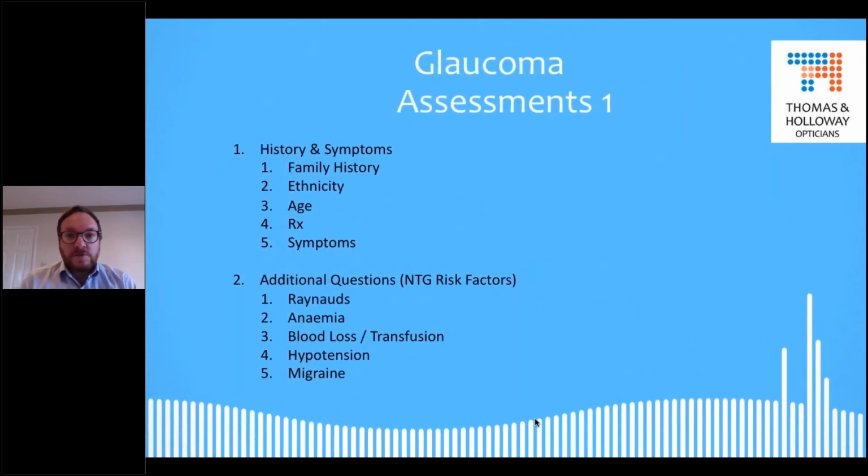So in terms of glaucoma assessments, as Tim's already said, glaucoma is very much a multifactorial condition, and therefore it needs lots and lots of different tests and analytics to be looked at in order to make a sensible referral. And remember, at that point, we're only making a referral. We're not even making a diagnosis. So let's just run through those.